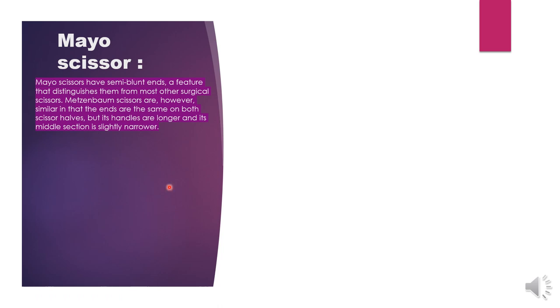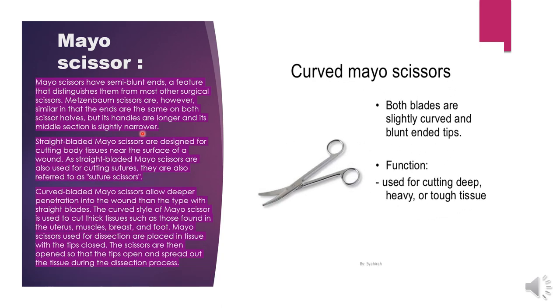Next is Mayo scissors. Mayo scissors have semi-blunt ends, which is a feature that distinguishes them from most other surgical scissors. Metzenbaum scissors are similar in that the ends are the same on both scissor halves, but Mayo scissors have longer handles and a slightly narrower middle section. Both blades are slightly curved with blunt-ended tips. Their function is cutting deep, heavy, or tough tissues. There are both curved and straight Mayo scissors, and they do not have a catch-lock system.